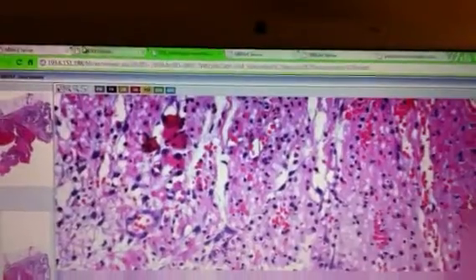Okay, forget about it. This is it. Wow, this is nice. Okay. That's it. I don't want to spend more time here. I'm guessing you don't want to either. Okay. Moving on.